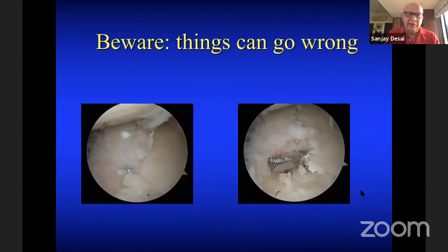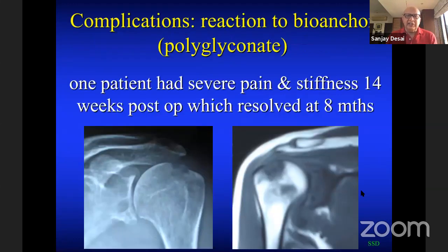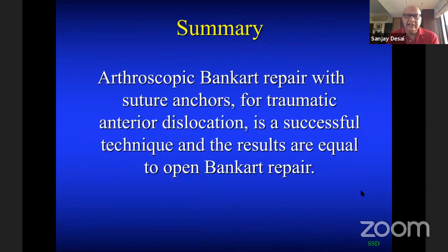A Bankart repair is not such an easy operation. You have to be careful. Things can go wrong. Here is a reaction to the 2nd generation of anchors, where there was a high tissue reaction. The patient had pain, inflammation. Eventually, it subsided with anti-inflammatory in time. But you got to be careful, just as with any other operation.